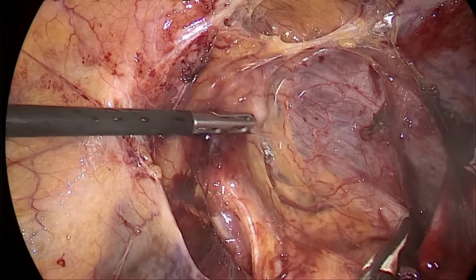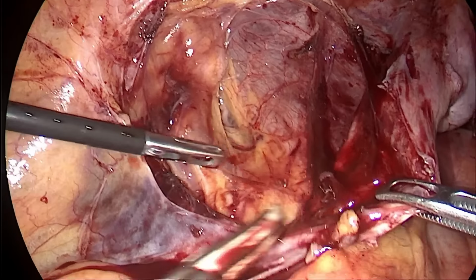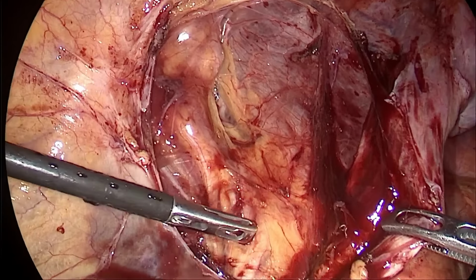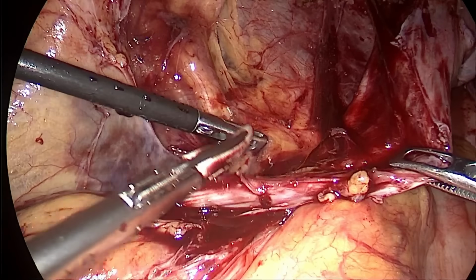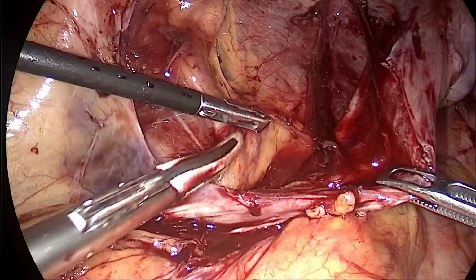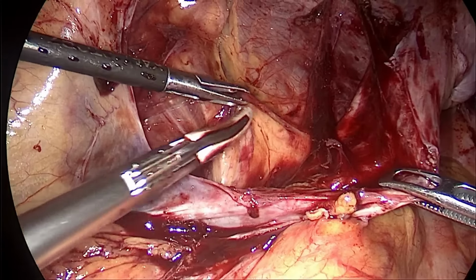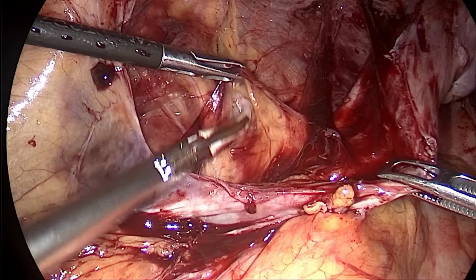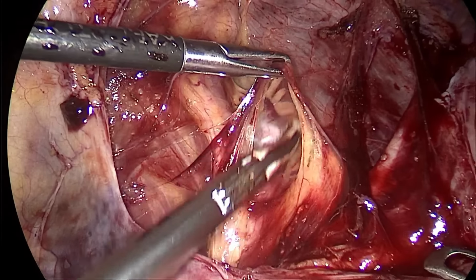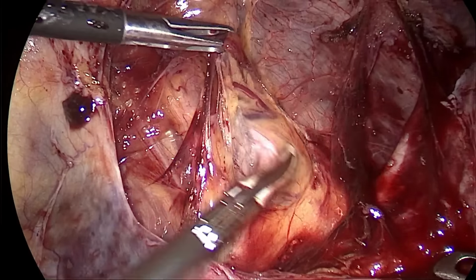So now we are trying to identify the ureter, our friend. That's our external iliac artery. Yes, so just beside the external iliac artery lies our ureter. I'm trying to delineate the ureter in a proper way.